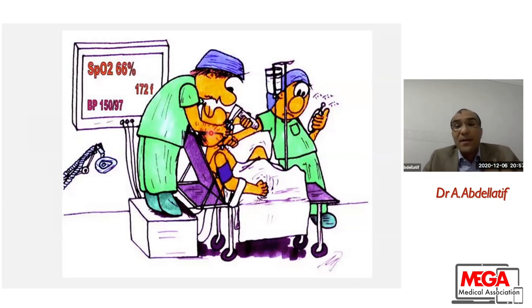So this is not a skillful assistant, and he is not helping the operator at all, and even the saturation is dropping to 66%, and he is not aware.